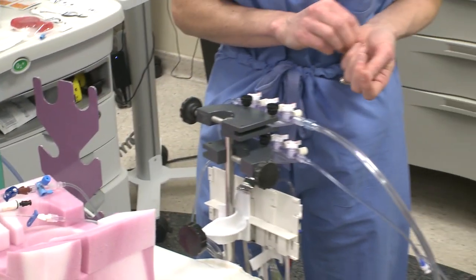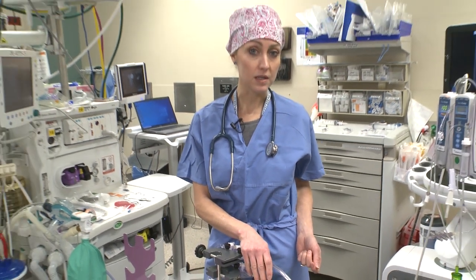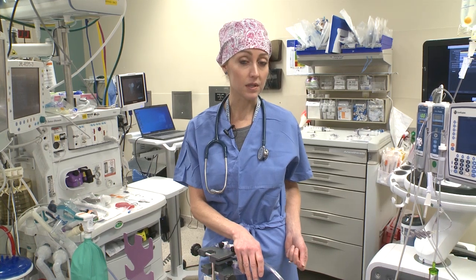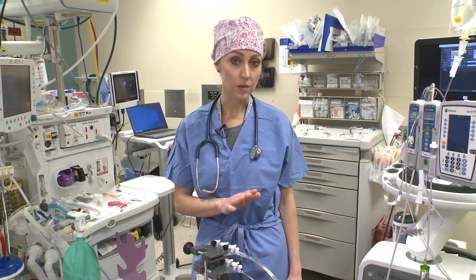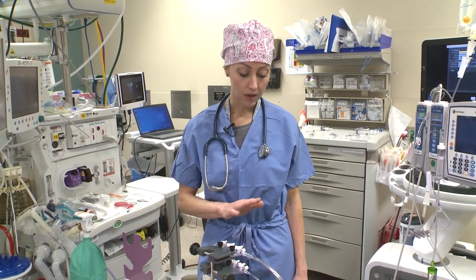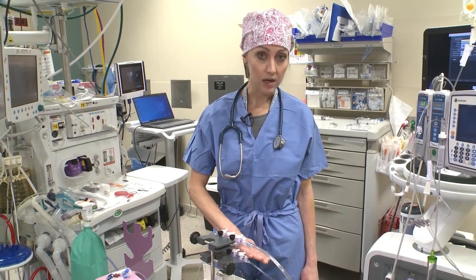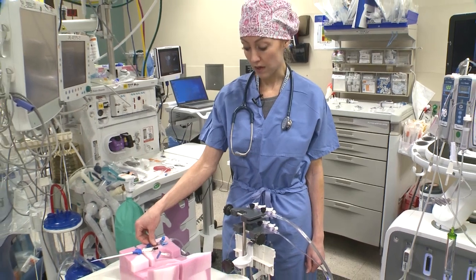We do that for a reason. As residents, you just need to learn the setup, and it's important that you're learning cardiac anesthesia — not individual attendings. We all do it the same way so you can focus on learning the cases, and also if you go into other rooms to help people, specifically in emergency situations, it's important to know exactly where your lines are and where they're going. So the hot brown line is always on the top manifold, the cold white is on the bottom — white and brown.